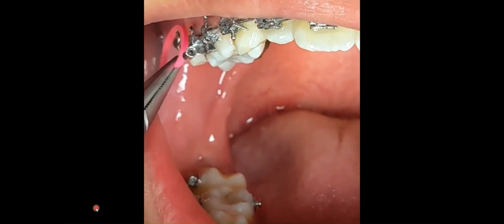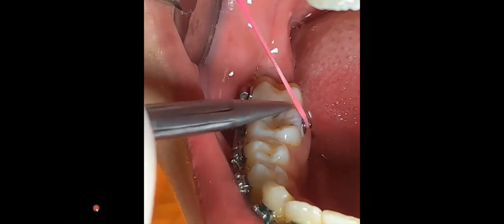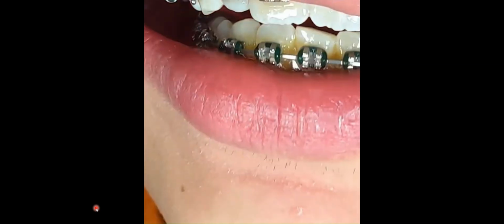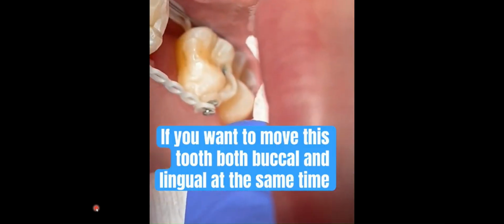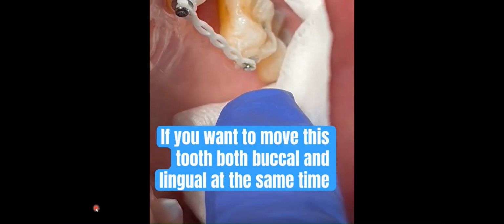Here is a video showing the use of lingual button for the attachment of elastics. Here is an example of a lingual button which is used to move a tooth both buccally and lingually at the same time.